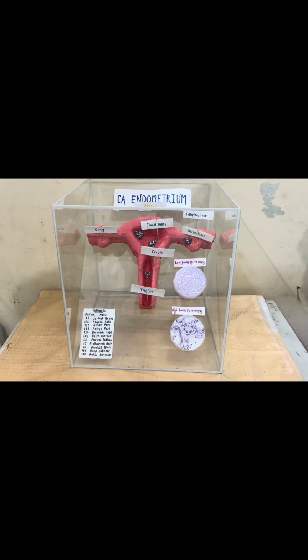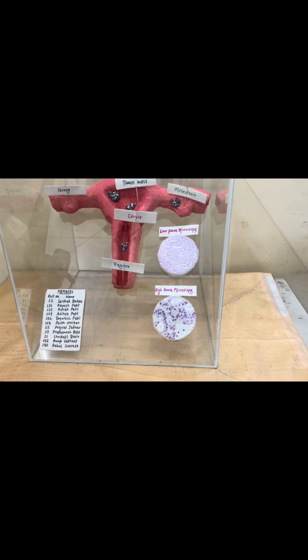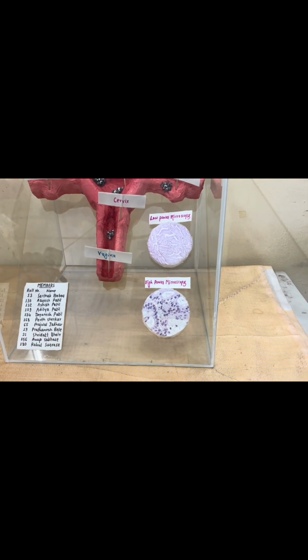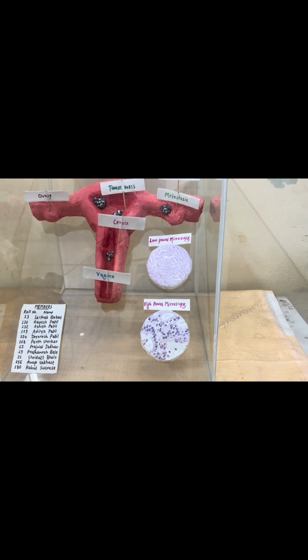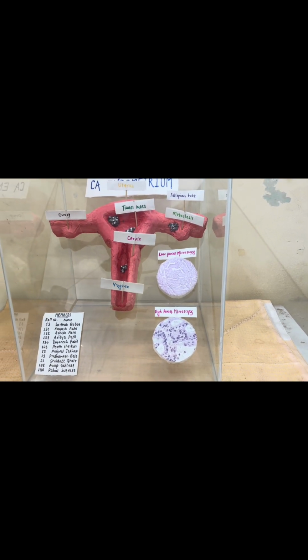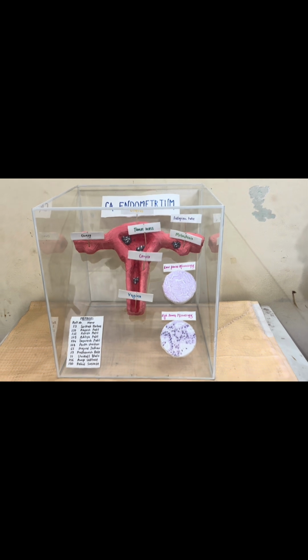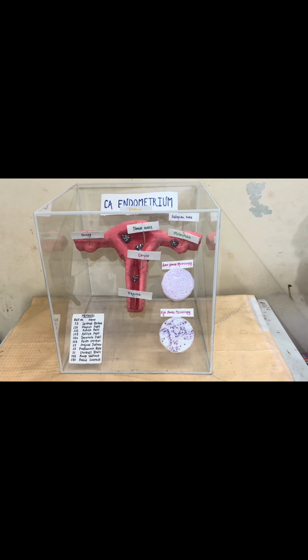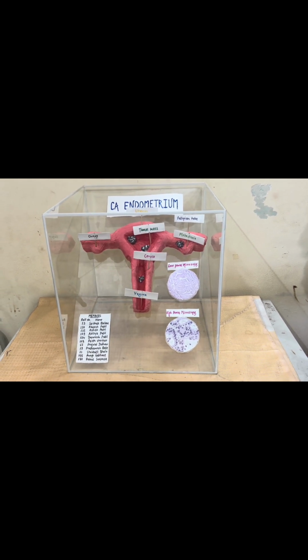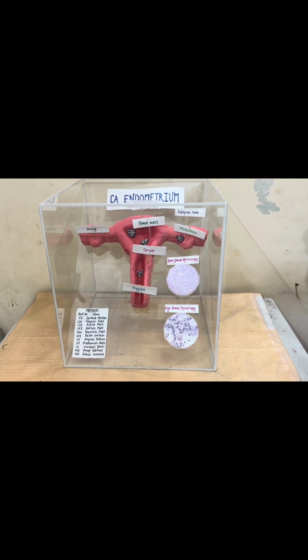Moving towards the microscopy, here the endometrial glands resemble normal, but there is architectural complexity. There are back-to-back glands with reduced or no intervening stroma. Here there is nuclear atypia, that is enlarged pleomorphic nuclei are seen with prominent nucleoli. The mitotic figures have increased, and this may also show squamous differentiation or mucinous areas in between. The invasion into myometrium may also be seen.